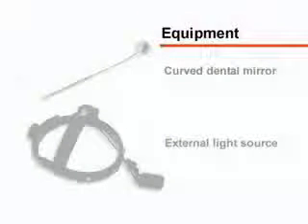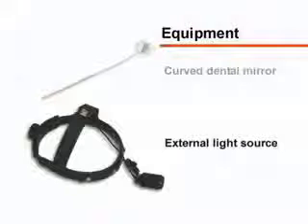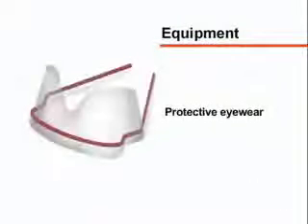For mirror laryngoscopy, you will need a curved dental mirror and an external light source. During laryngoscopy, the examiner should use protective eyewear to prevent exposure to bodily fluids in the event of a sudden sneeze or expectoration on the part of the patient.